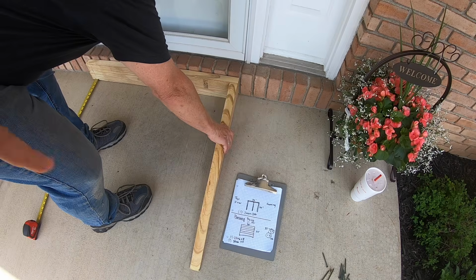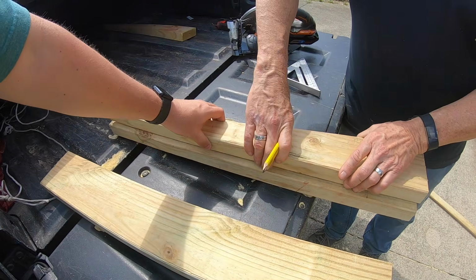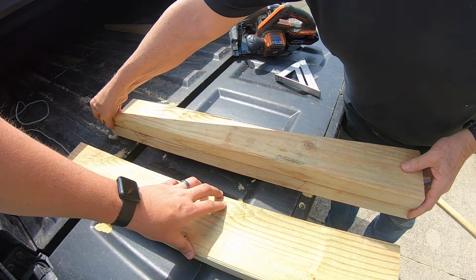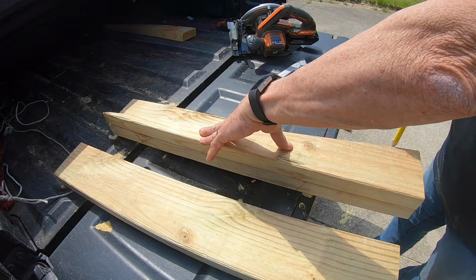And we're actually going to cut 2 more of these and use this as a template. We're going to go ahead and take the new piece that is the proper fit, go back to the other 2 that we cut. This will allow us to make sure we get the same thing, and so you're just going to use it as a template just like that.